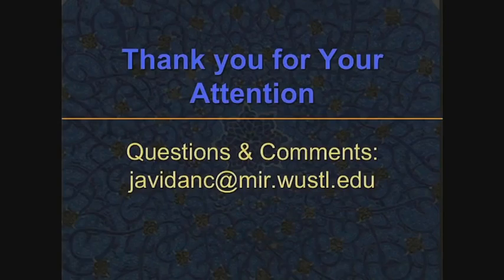Thank you. So now I'm going to go through cases, and you'll see how we basically approach these cases in real life, and that's where our audience response questions will show up.